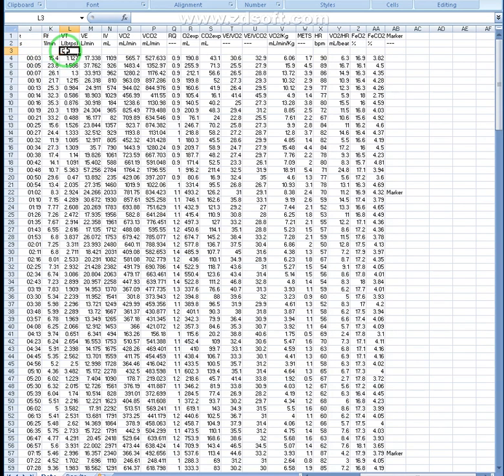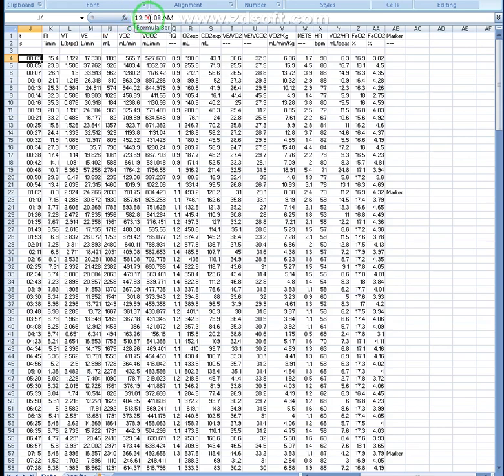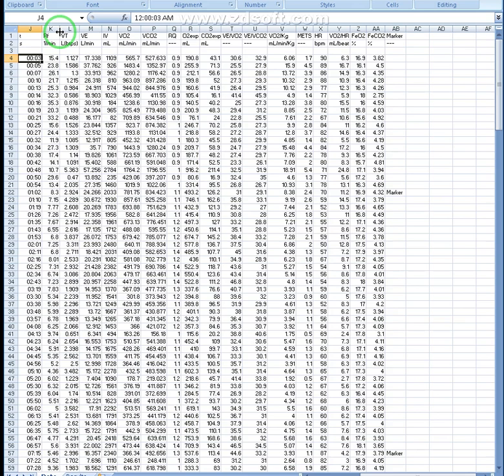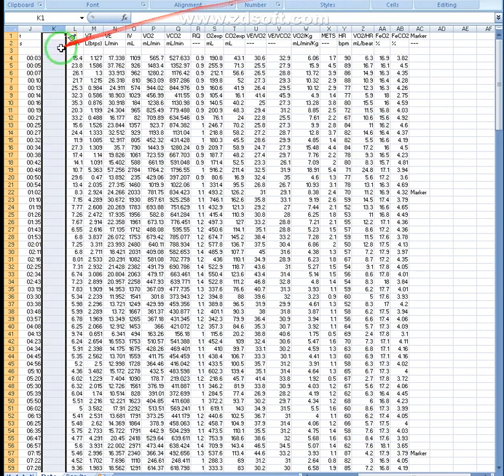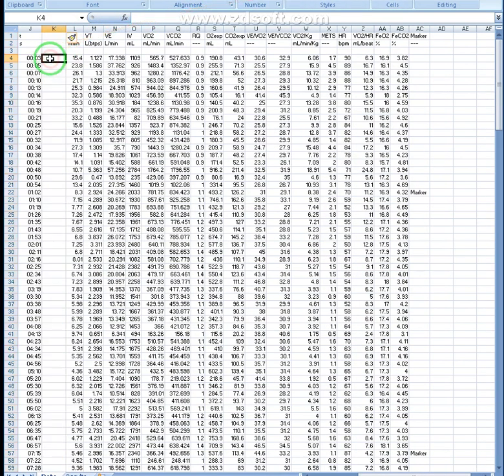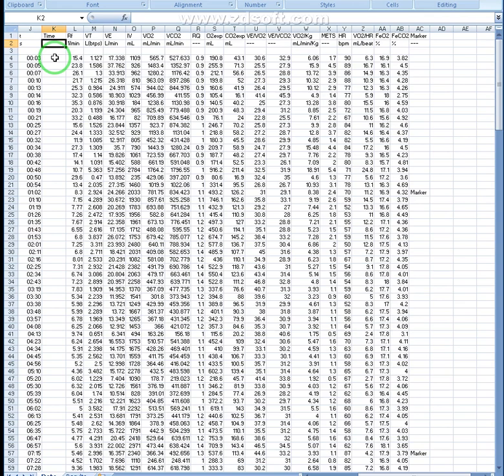So where we'll start is, we'll start with time. So time here is 12 hours, 0 minutes, 3 seconds AM. It's not going to be very useful for us to use this because it won't know what to do with that time format. So first we're going to come here to column K and insert a column. And we'll call this time, even though the time next to it is. It says seconds, it's not really, unfortunately. They got that wrong when they did it. We're going to put ours in minutes.